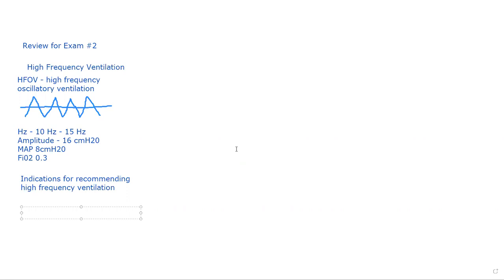Any leaks, and am I missing one? I feel like I'm missing another reason why the mean airway pressure fluctuates. So check it in your notes. How do you know when to suction a patient on an oscillator?